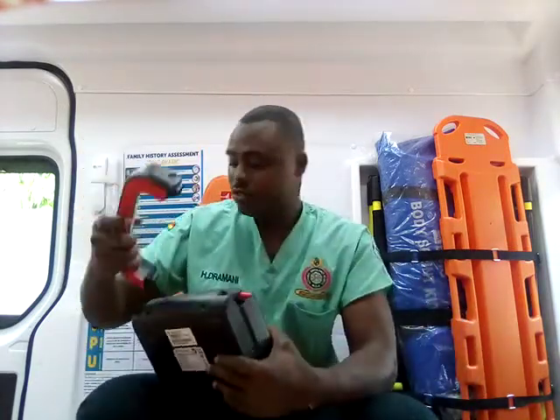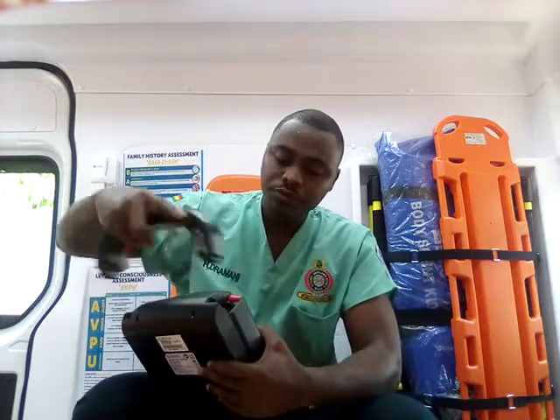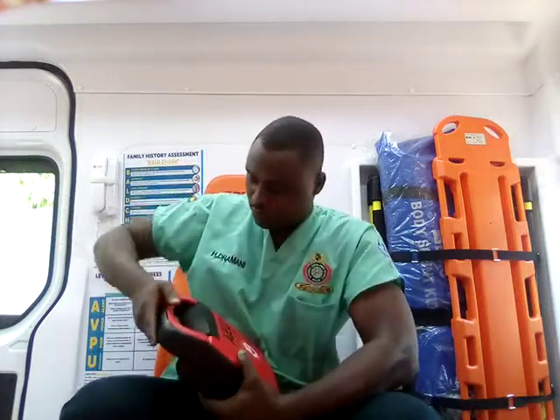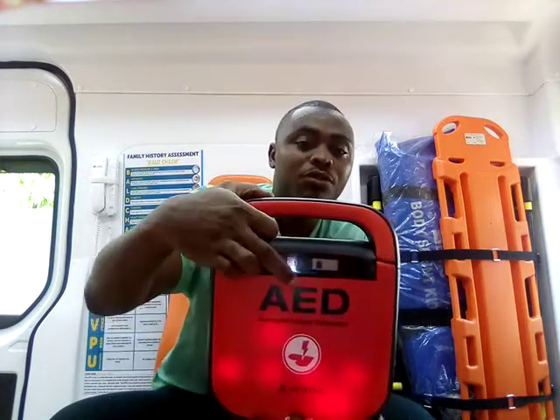Now, let me apply the battery to it. As soon as I apply the battery, it tells you unit okay. The indicator moves from the X, which is red in color, to O, which is blue in color. You also see that the battery indicator is full. Now, as I slide it to the right side, it opens, and as it opens, it turns on on its own, and then you follow the prompt.